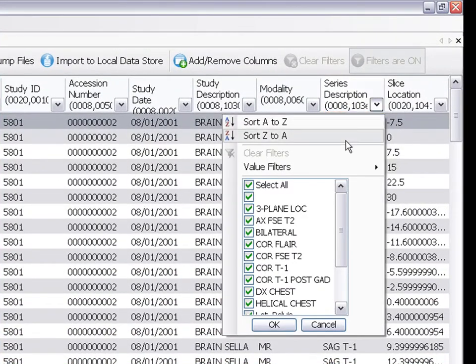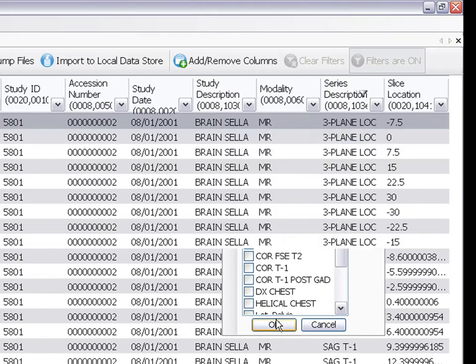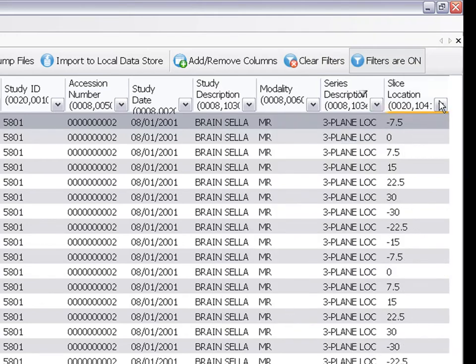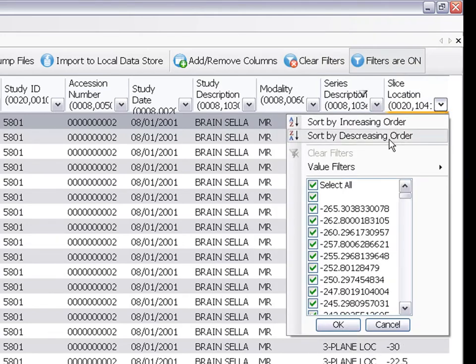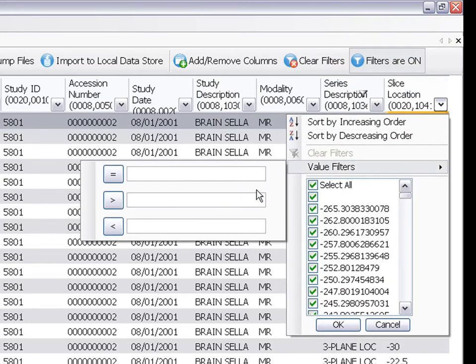Select the series that I want based on its description, and enter a range of values for the slice location.